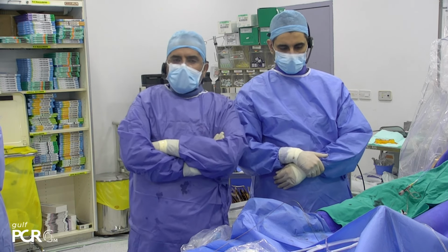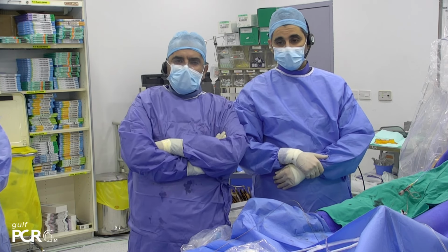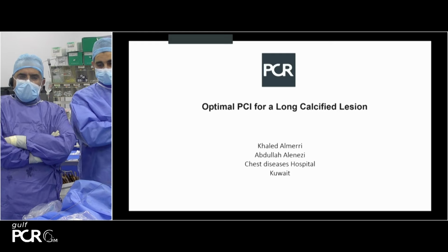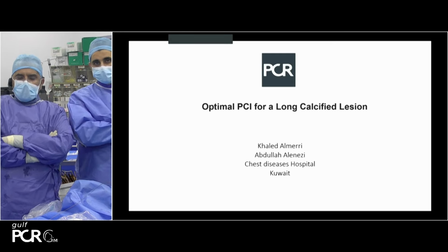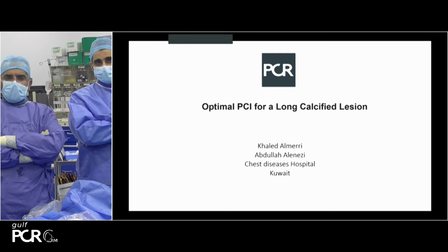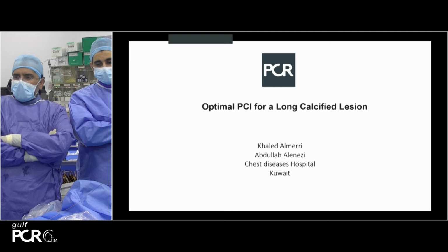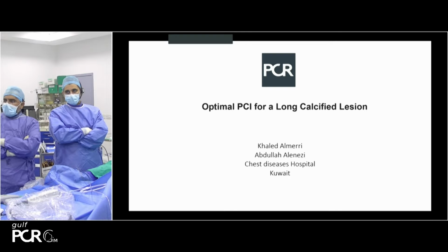Great. So in this session, we're going to show a patient with calcified vessel who is non-operable with diffuse disease. And the proximal LAD has a nodule in it. So I'm going to go over our strategy in this patient. If we go to the next slide.